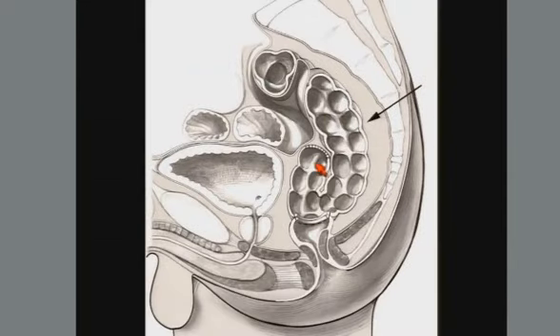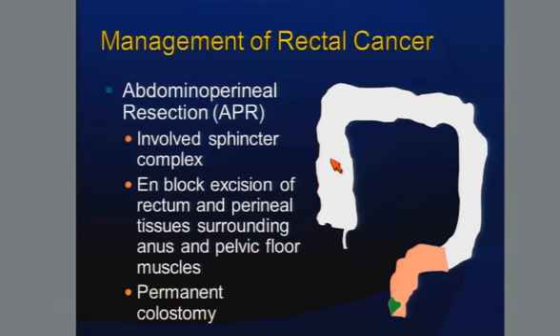This is a pictorial representation of a pouch creation. They can be very funny in appearance. They aren't sort of classic, this is exactly what one looks like on every exam. So you have to be prepared for unusual appearances of pouches as you image these patients postoperatively.